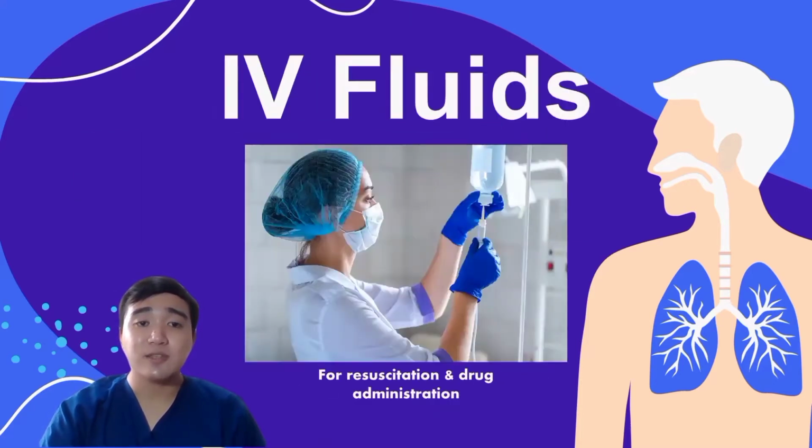Next, I stands for the IV fluids. Now, we must establish IV access to ensure adequate hydration and avoid hypovolemia and further hypotension since our patient is already hypotensive. It is also used for establishing the route for administration of the drugs.